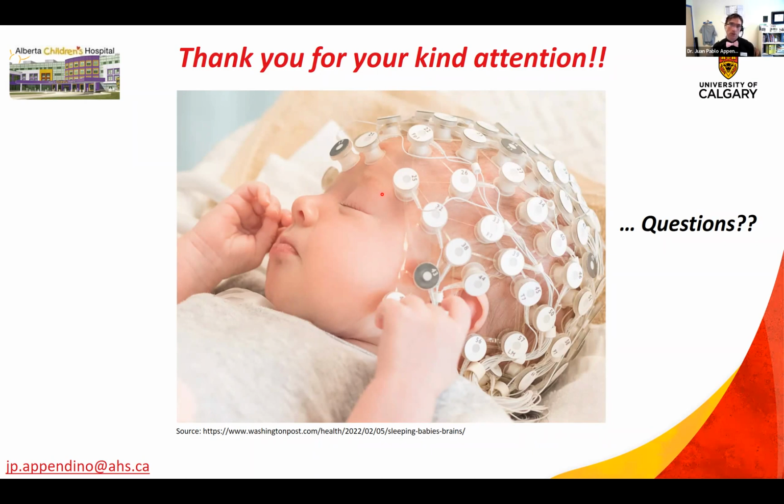In our institution, we have a protocol. If the baby comes with query seizures or episodic events, we monitor for 24 hours. If no seizures, then we disconnect. If we are at 20 hours before the tech goes home and the brain activity has been normal so far, then the chances are low to have seizures as well. So we tend to disconnect, but usually we need at least several hours. It's a very good question that I don't have the precise answer for you.